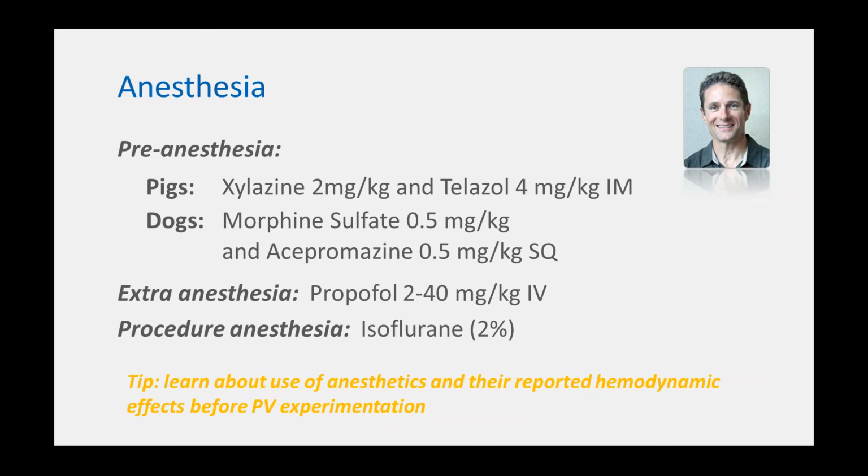You might find that different anesthetics and their hemodynamic effects might affect your experimentations more. So figure out which ones work best for you. These aren't absolute by any means.